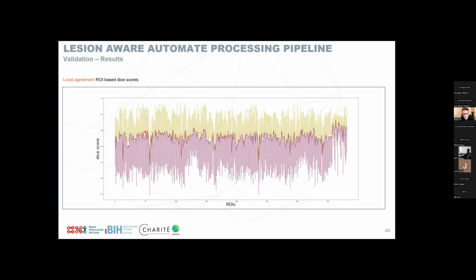results, as opposed to the HCP, which kind of makes sense if we think about where this variance comes from. And this comes in particular from, for example, the lesion size. We can think of having very small subcortical lesions, not having a lot of impact on the processing, even if we don't mitigate for this lesion. But then again, if we think of these large lesions, for example, that we've seen before, we can think of very strong differences if we do not account for the lesion. So we have a lot of variance depending on what subject we're actually processing for the HCP data, and not so much for the LEAP, because we're actually mitigating the impact of those lesions.